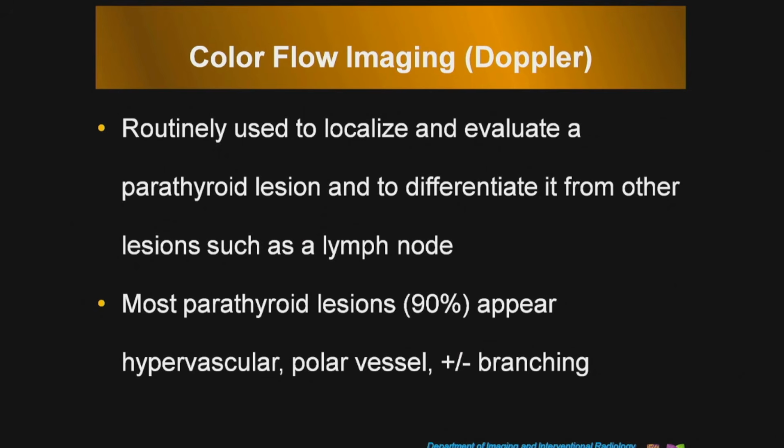When you see vascularity in a parathyroid adenoma, whether it is intrathyroid or extrathyroid, it has one single penetrating vessel that comes from one of the poles, usually the superior pole of the adenoma. Sometimes it branches within the adenoma, or sometimes it does not. We used to see this, and this became, in my mind, a hallmark of parathyroid adenoma. Today when you read, you will read Bob Sofferman's polar vascularity in a parathyroid adenoma.